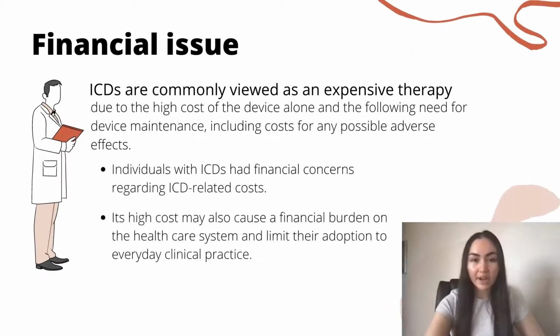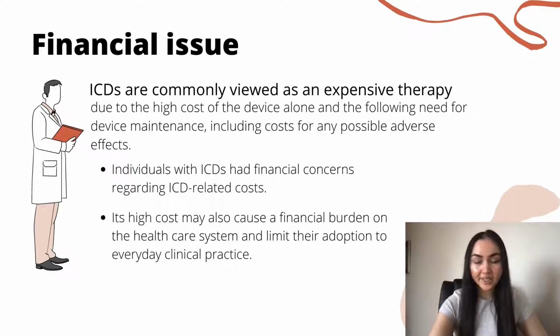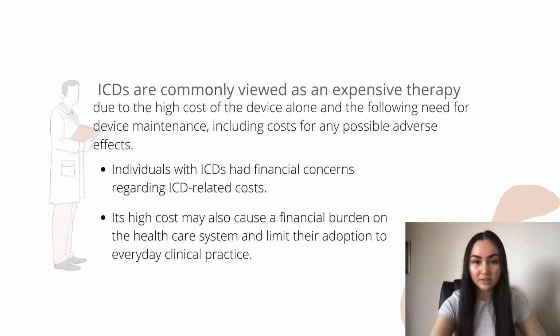Because of the high cost associated with the ICD, they are commonly viewed as an expensive therapy. A study found that individuals aged 18 to 40 years old had concerns regarding ICD-related costs, expressing their fears of not being able to offer financial security for their families. Moreover, as the indication for ICD therapy expands, an increase in the potential number of implants also follows, which may cause a financial burden on the healthcare system and limit their adoption to everyday clinical practice.